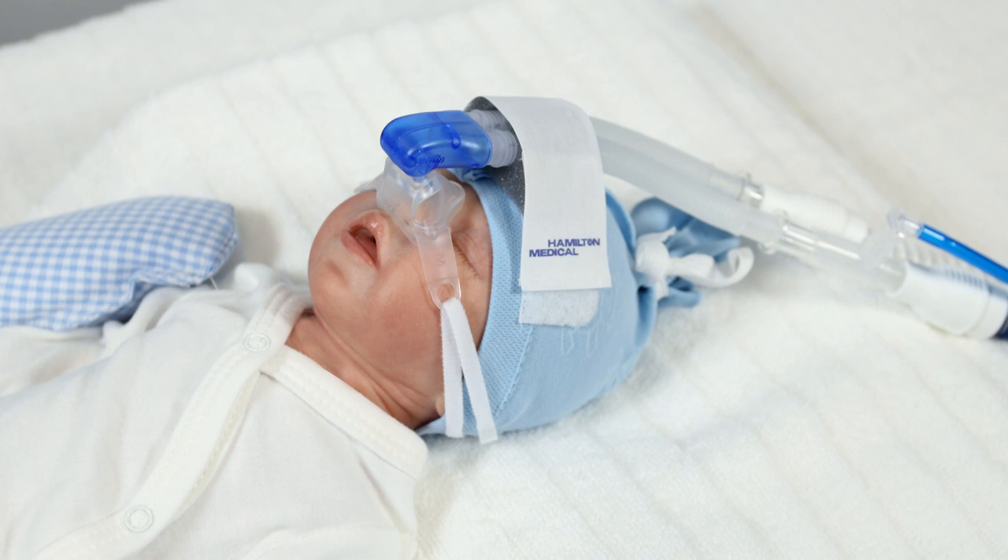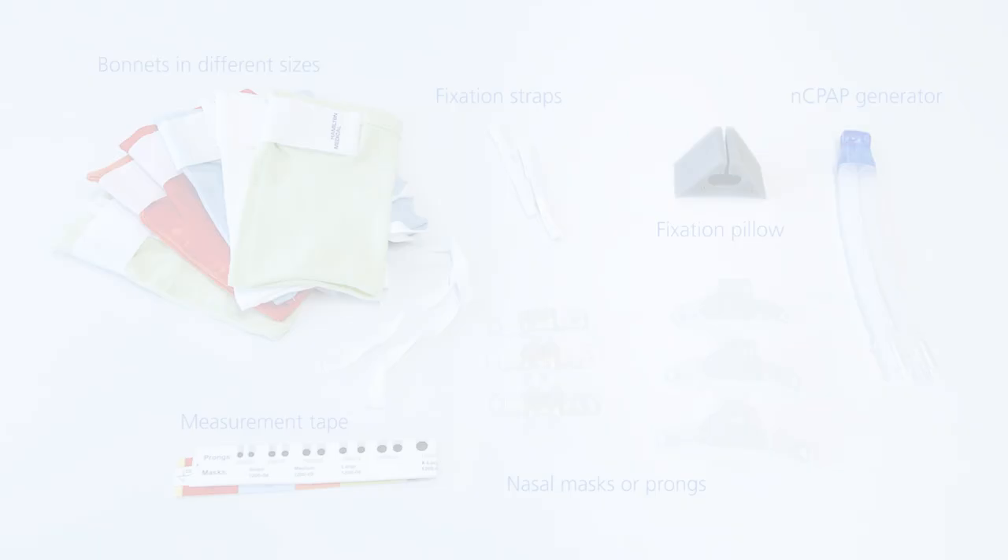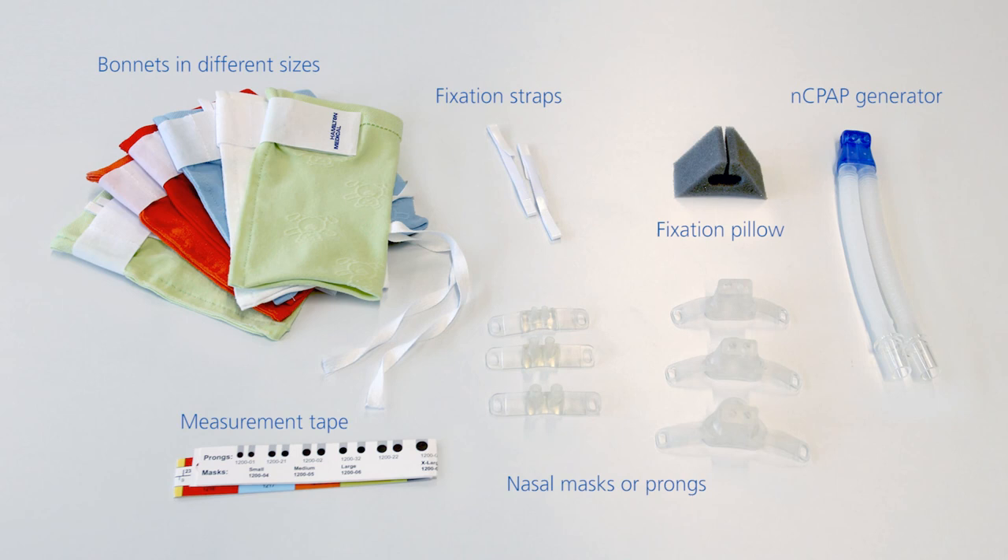This short video demonstrates the correct use of the Hamilton Medical NC-PAP interface for neonates. You need bonnets in different colour-coded sizes, an NC-PAP measurement tape, masks or prongs, a fixation pillow, fixation straps, and an NC-PAP generator.